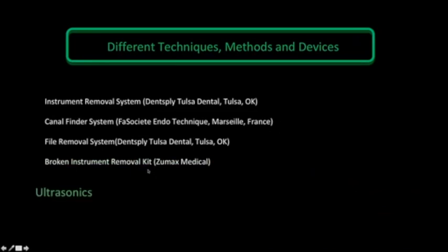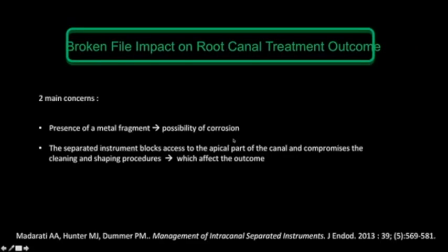Very often, all these devices are aided by ultrasonics to vibrate the file and retrieve it, or help prepare the staging platform.